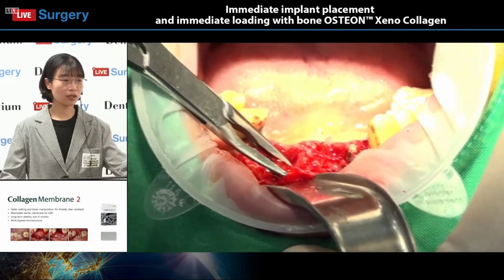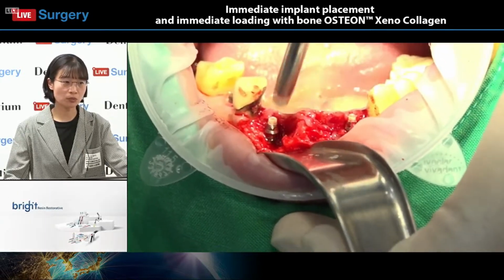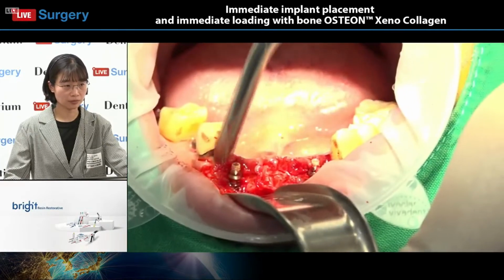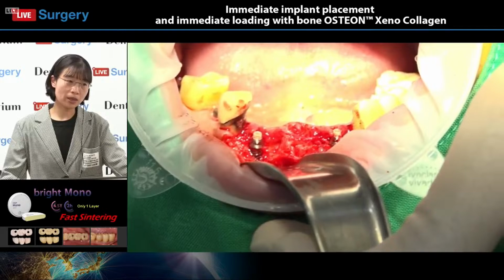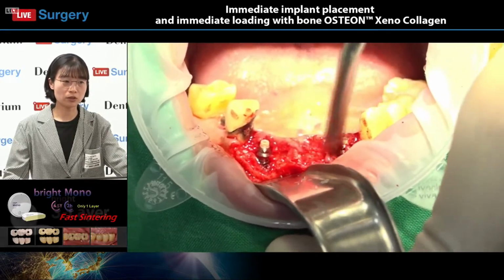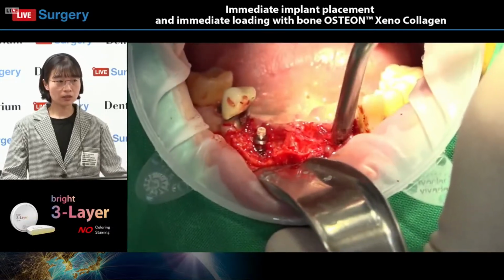Yes, he trimmed the bone well for a smooth bone surface. Sometimes the sharp bone defect causes pain to the patient after the surgery. So we have to trim like this.